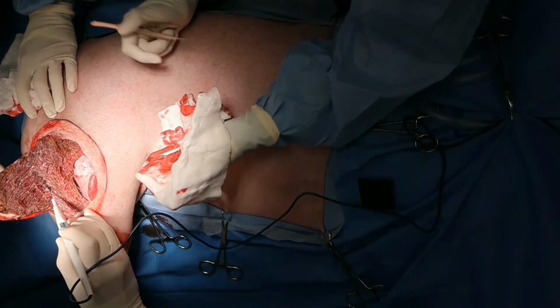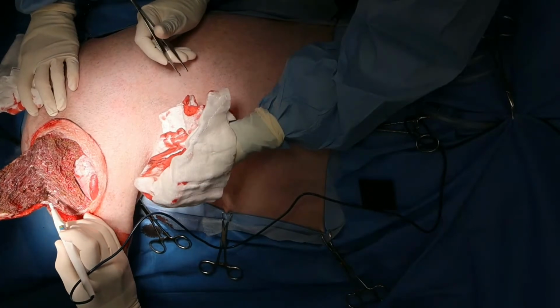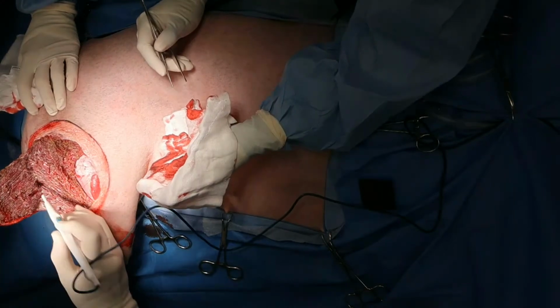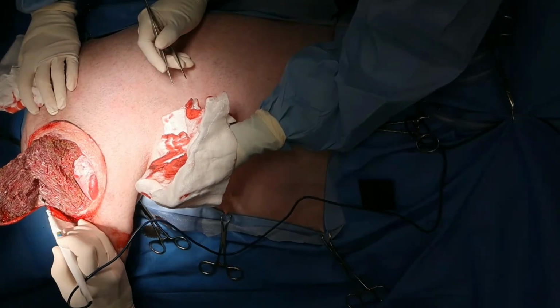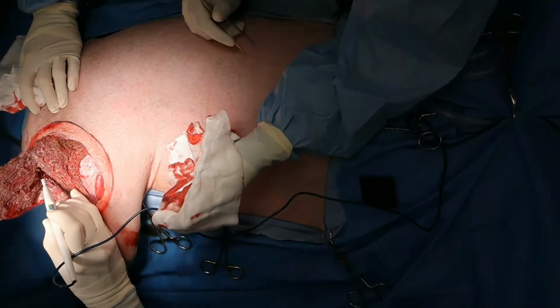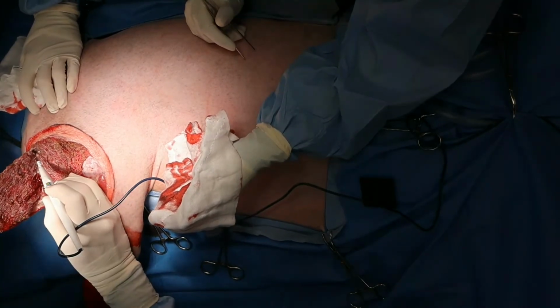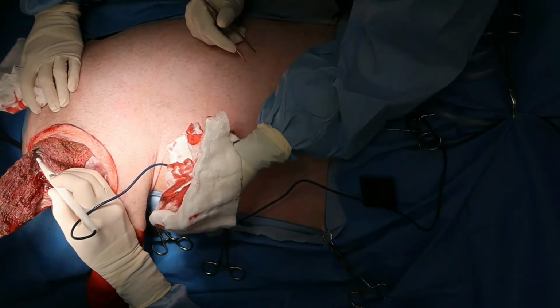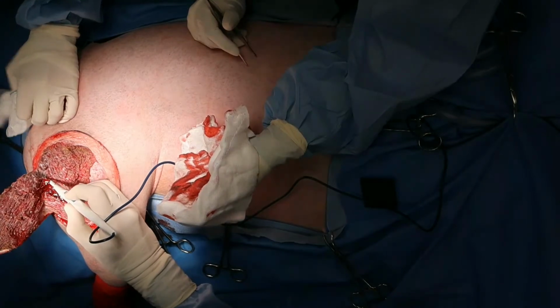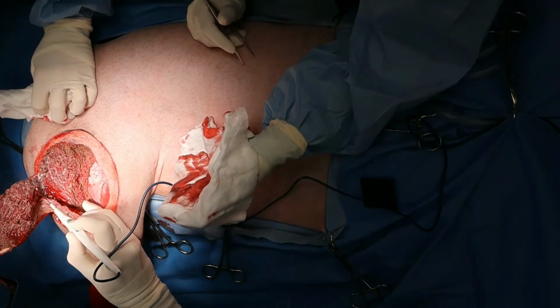So to see how much of that biceps muscle I'm taking. Yes, I understand now. And this leg will function normally. It'll be walking tomorrow on it. Wow. As I often say, it might be at a selective disadvantage if it was fighting for its own food in the savannas of Africa, but on the sofas of Brighton, it'll be fine. And we've got one opportunity here to get a cure, and so we just go for it.